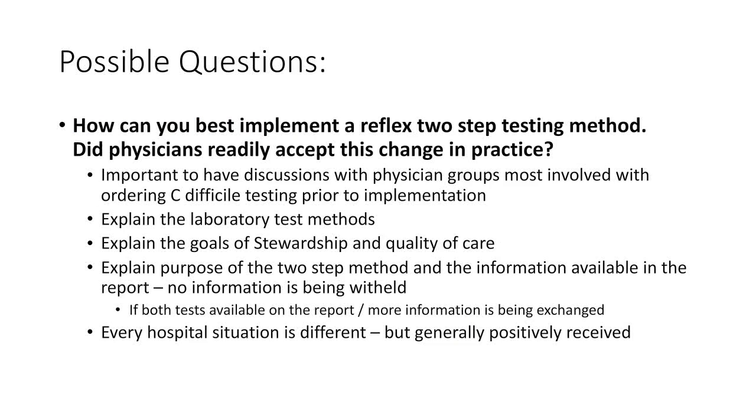More questions. How can you best implement a reflex two-step testing method? Did physicians readily accept this change in practice and accept those reports that I just discussed? Well, I'll tell you, it was a rather exhaustive campaign to get all of this started, and I think it is very important to have discussion with physician groups most involved with ordering C. diff testing prior to implementation. We went to GI groups, our general medicine groups, infectious disease. We also had some discussions with some of our residents and fellows because they order a lot of the testing and read a lot of the results.